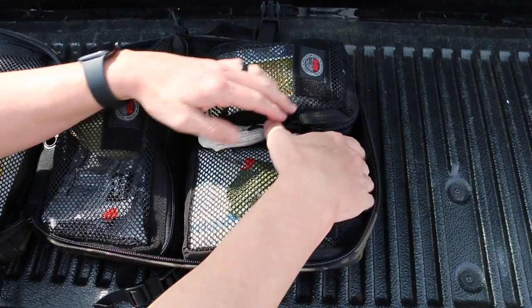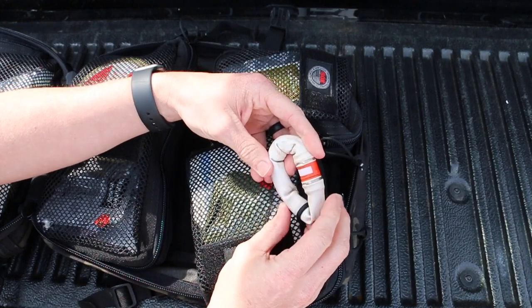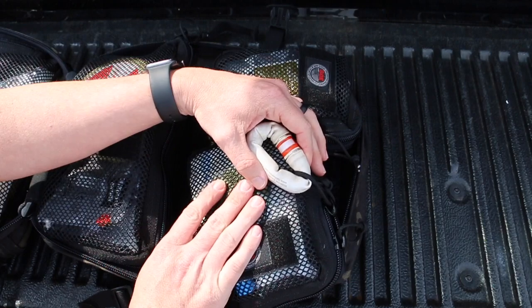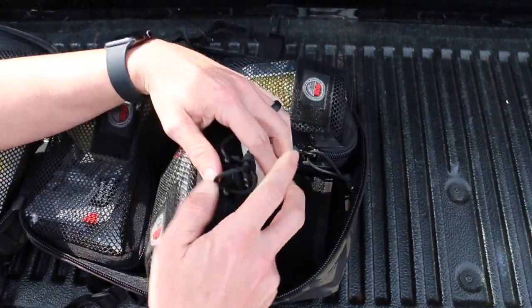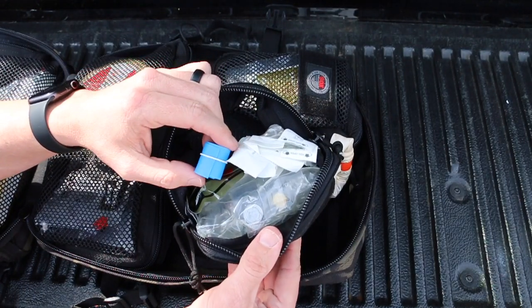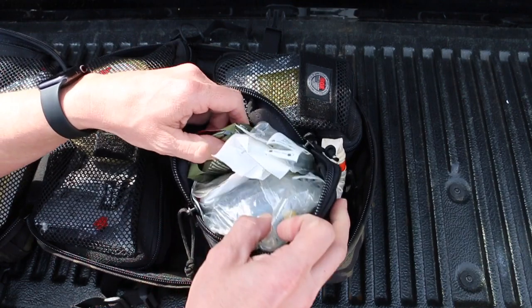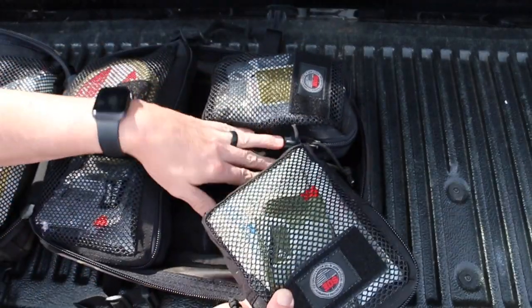This last pouch is my IV supplies. I have a BOA tourniquet made by Gnar — a great tool when someone's a really hard stick. You clamp it down and roll it down, which really exposes the vein. It's especially useful when someone's in shock, whether from vomiting or blood loss, to help get an IV started. I also have a regular IV tourniquet, needles, IV catheters, needles for the medications I carry, and IV fluid with a drip set — all my IV start supplies secured in this pouch.